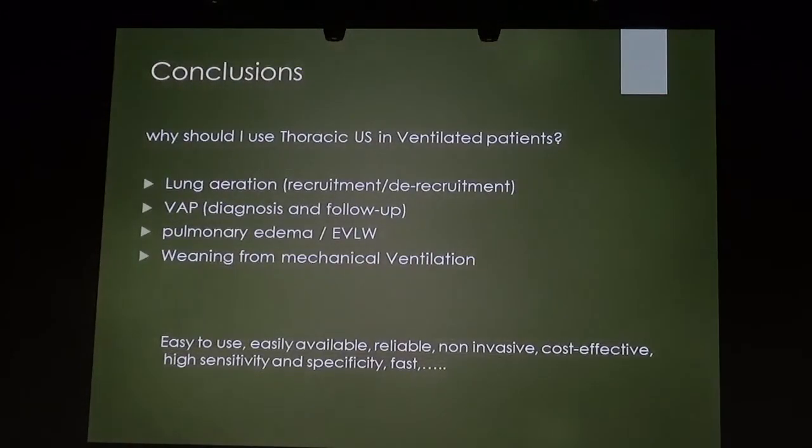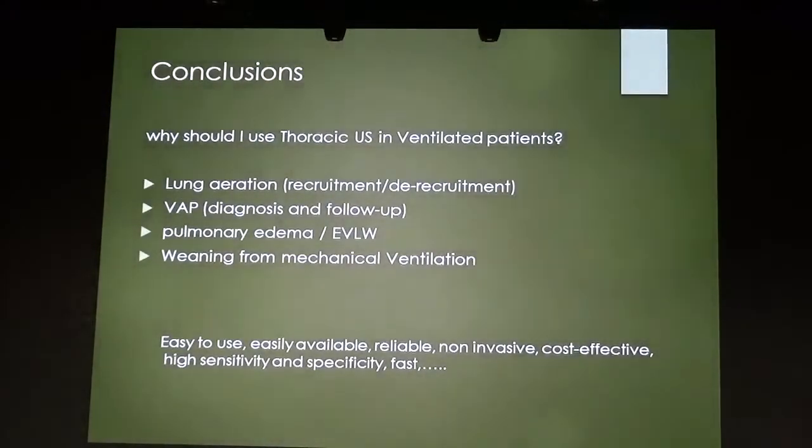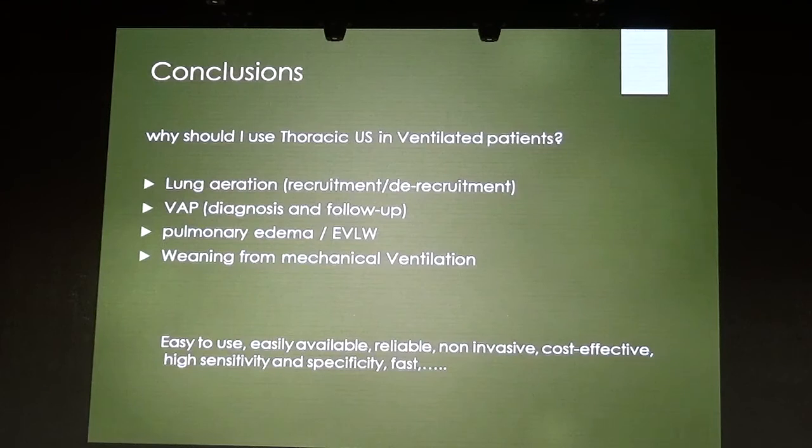And to conclude, I would like to show you that ultrasound can be used to assess lung aeration with a good accuracy, to diagnose and follow up, for example, ventilator-associated pneumonia, pulmonary edema. It can help in the process of weaning from mechanical ventilation.